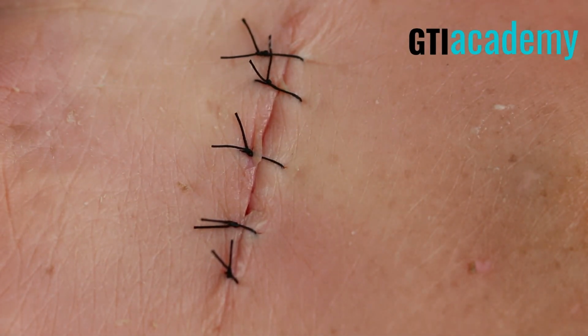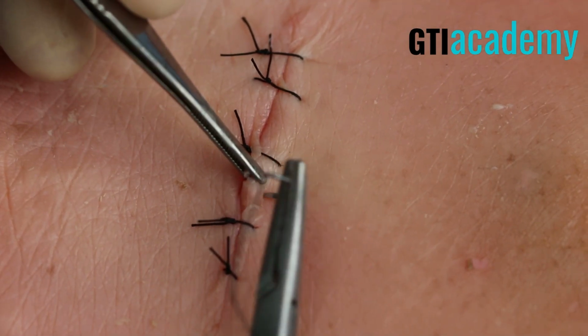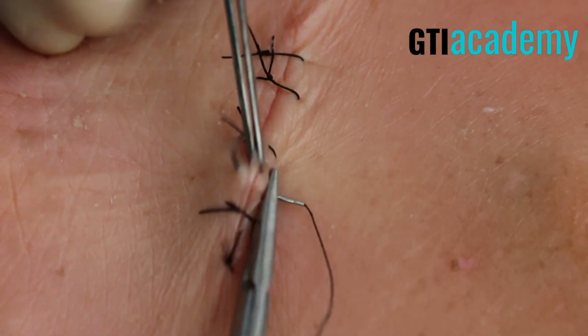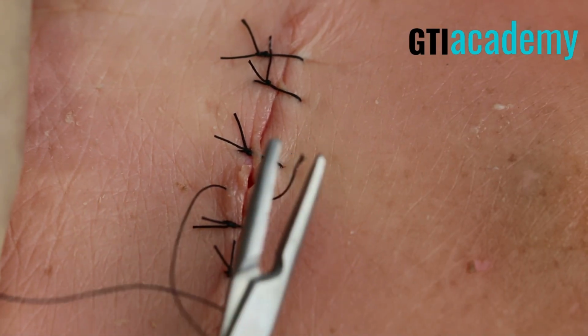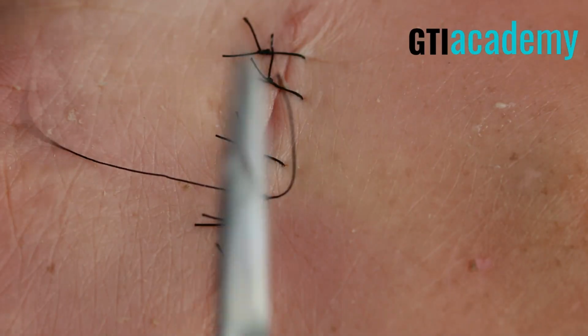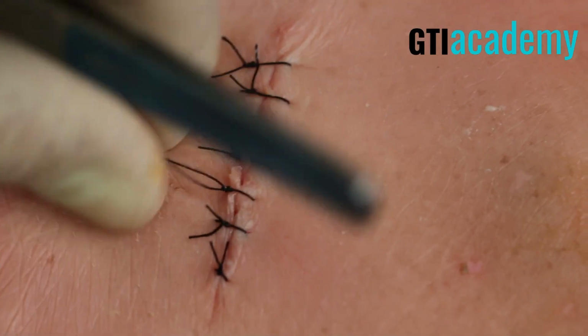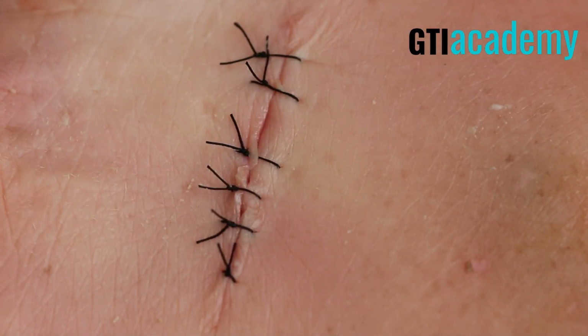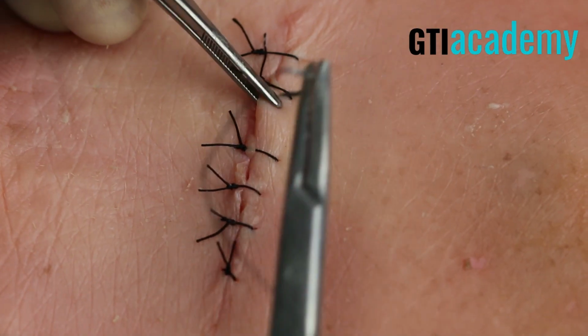As you can see, just a few more areas that aren't well approximated. 2, 3, 4. So we'll do right here in these 2 large spaces. Remember, simple interrupted suture really is for wounds that don't have a lot of tension on them and are superficial, that aren't really deep. This wound actually is very perfect. Nice surgeon's knot here. And a third. Let's pull this knot to the left to make all of them be on the same side. Again, equal lengths. Looks like there's one more space right there we can address.